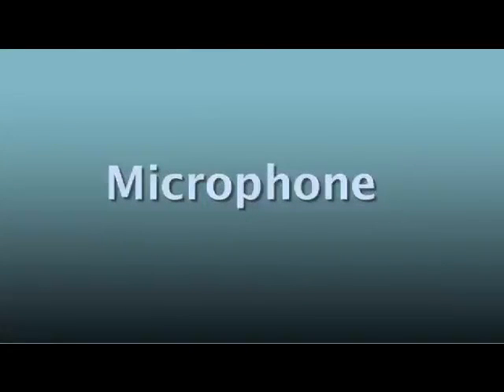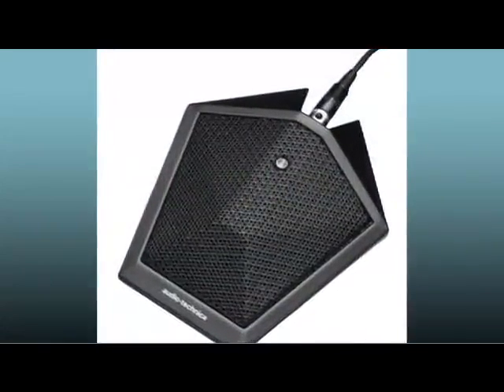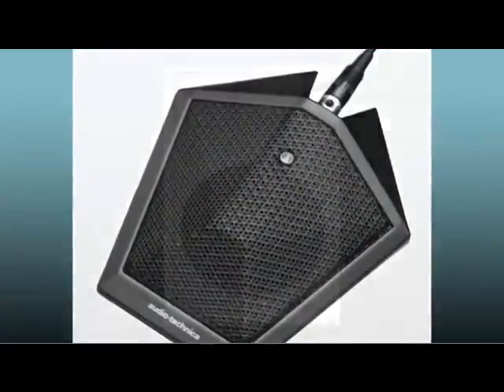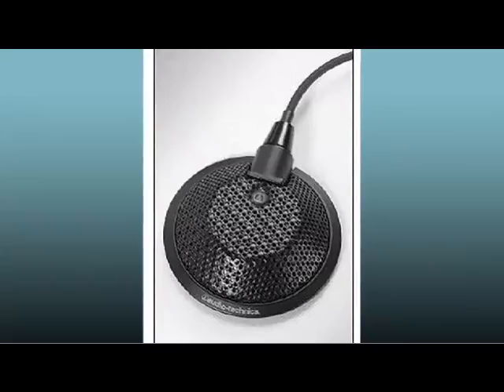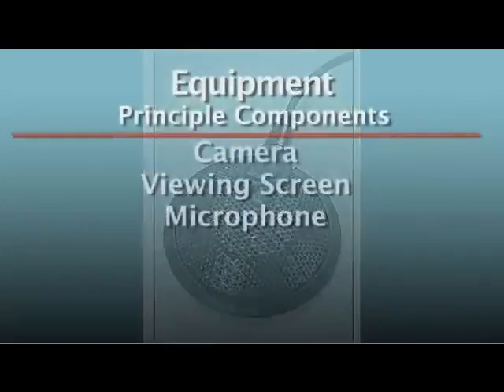The third component is a microphone. The microphone allows the patient and clinician to talk to one another. Placement of the microphone will impact the quality of the audio. Microphones are usually placed in front of the provider, hung from the ceiling, or attached to the telemedicine unit.